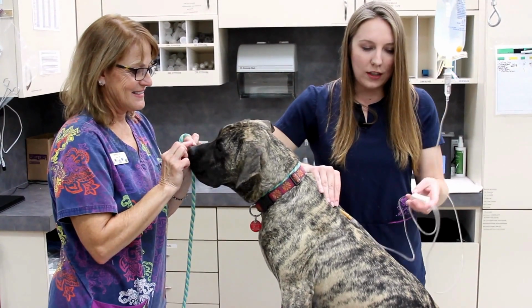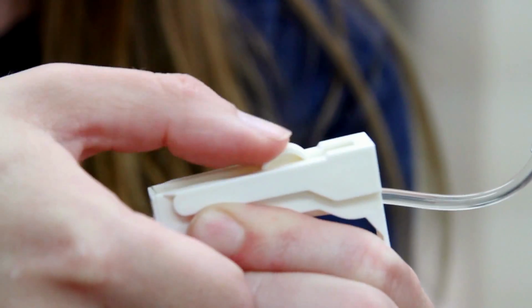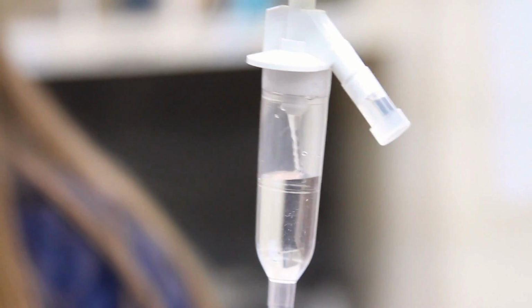We're going to use this roll clamp here. We're going to roll it upwards in order to start releasing the fluids. And then you'll see the fluids are going to be flowing in the hub there. You're going to keep an eye on your fluid bag.